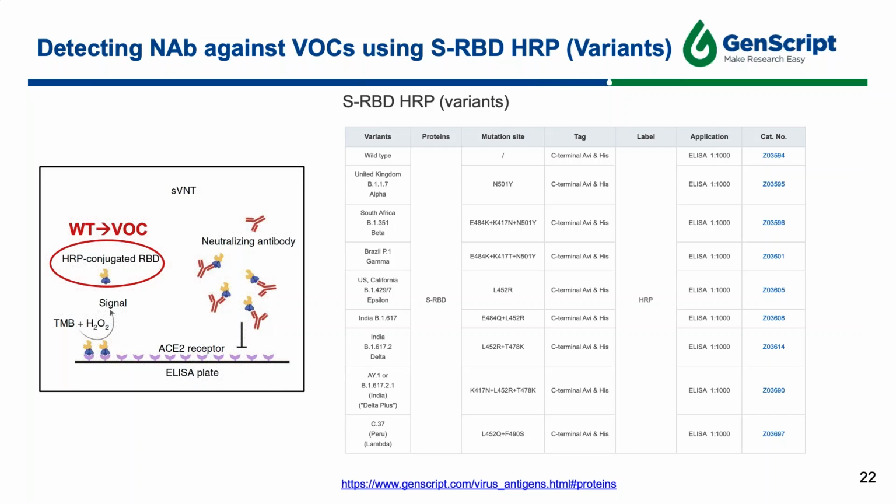Yeah, okay, but take note, if you wish to test against both the wild type and the variants, you will need to perform the test in different wells. So you will need to purchase extra components to do the study.